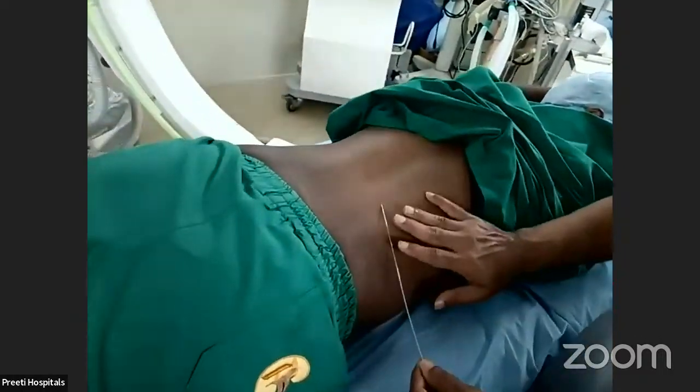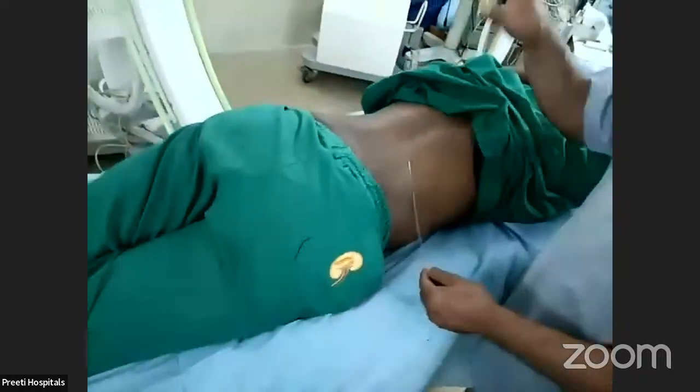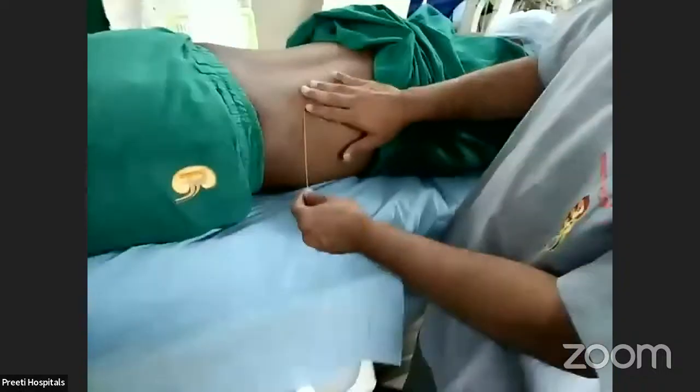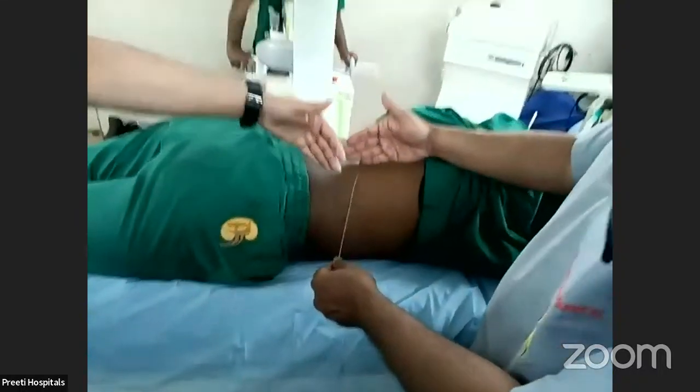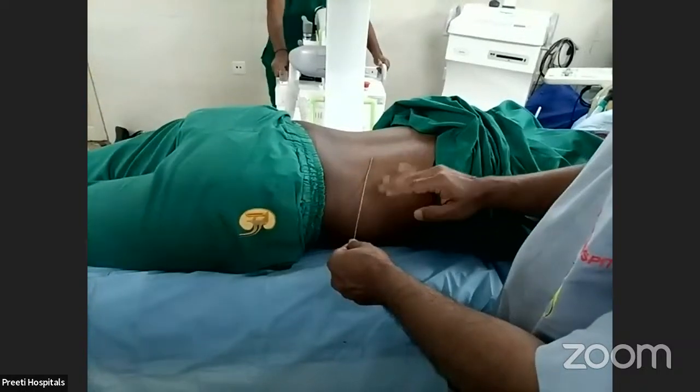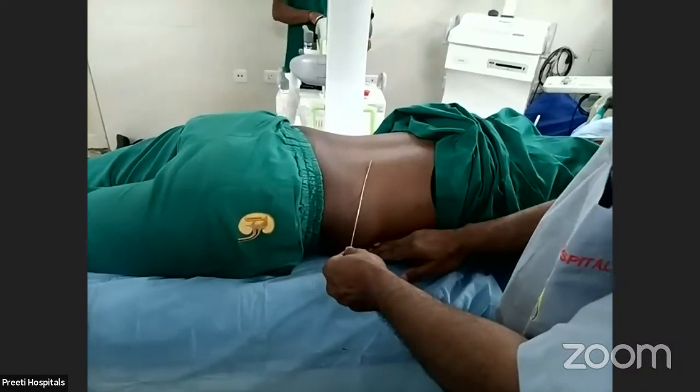In prone PCNL, when the needle is kept like this, at 0 degree, what information will you get? At 0 degree, we can tell whether the needle is up or below, medial or lateral. Depth, can you tell? No, we can't tell about that.